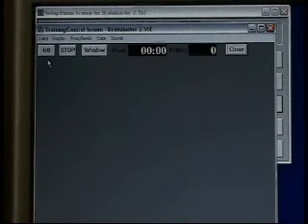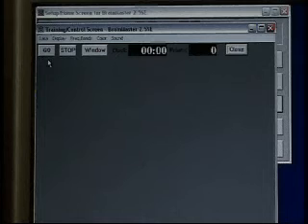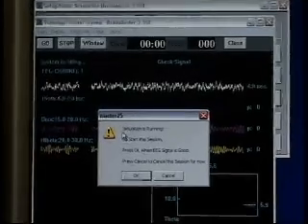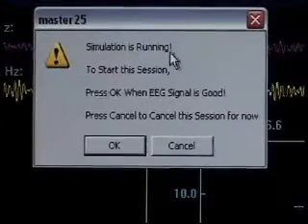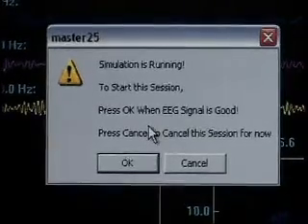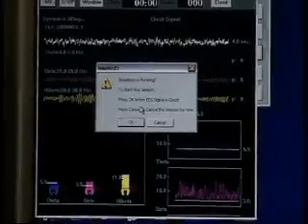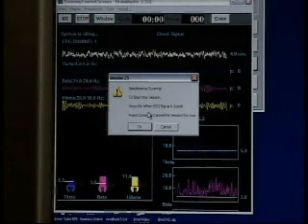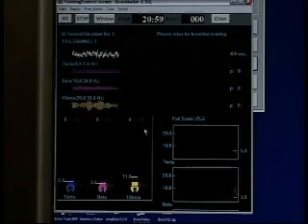We're ready to hit Go. Our current protocol is on a simulation for demonstration purposes. As I hit Go, it's going to tell me simulation is running. This control box tells us 'Master 25, simulation is running. To start the session, press OK when the EEG signal is good.' Now if you actually had a client hooked up to the BrainMaster right now, you'd be verifying that you had a nice clean signal. We're currently just running saved random noise through a signal generator, so it doesn't really look like EEG, but it's still powering the panels and the different optional displays. As I click OK, my session begins.